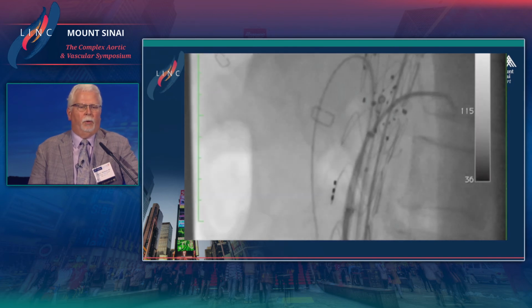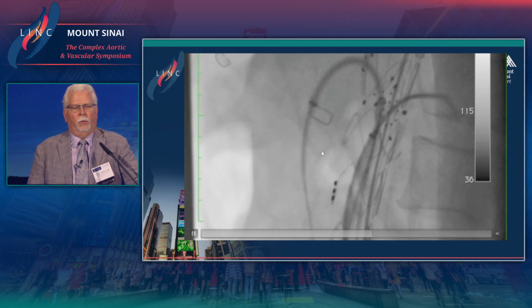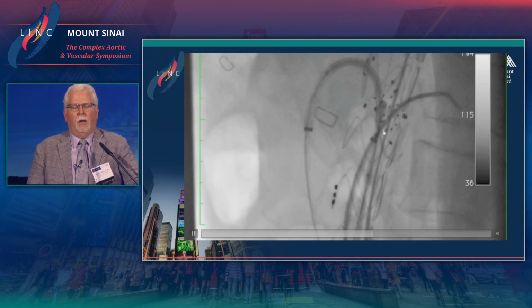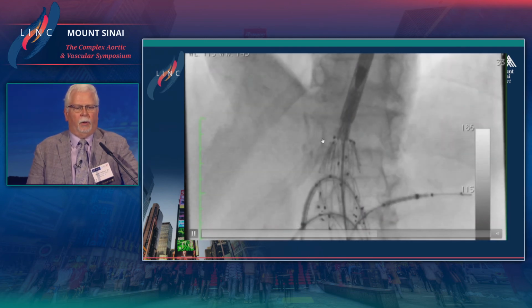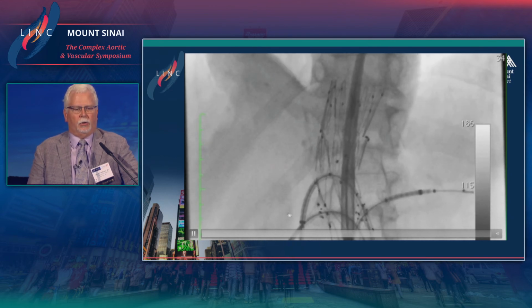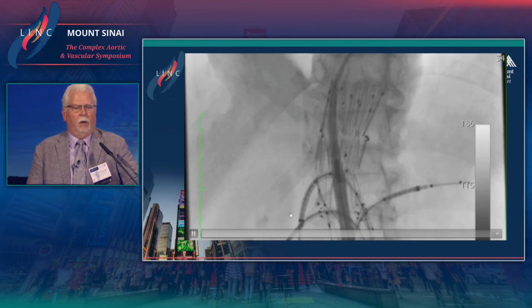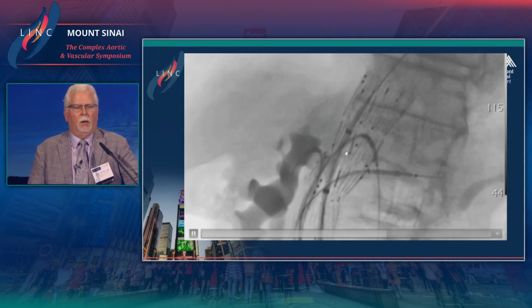Once we have it going through, we'll then come up with a catheter wire and then a sheath over the Rosen wire here. So now we've had catheterization of SMA, putting our stent out to act as an obturator there. We then remove the through and through wire and then deploy the top cap. Sheaths and dilators go out into the renal vessels as shown here. Again, this is an off-the-shelf device, so it makes it much more convenient.